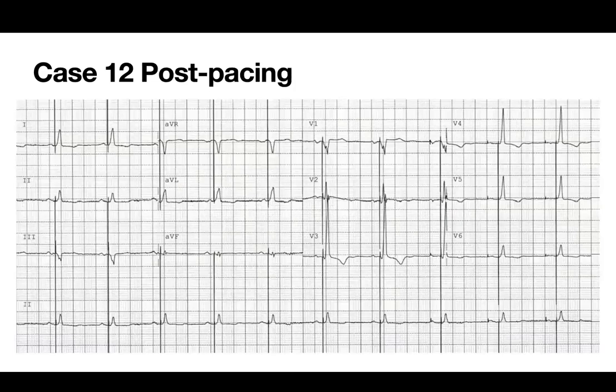So we put in the left bundle branch area pacing, it looked like a mid kind of location, and LVAT like 75 milliseconds, and then it's nice and monophasic in aVL, but no R wave in V1. Dr. Philippon, would you advance it more?